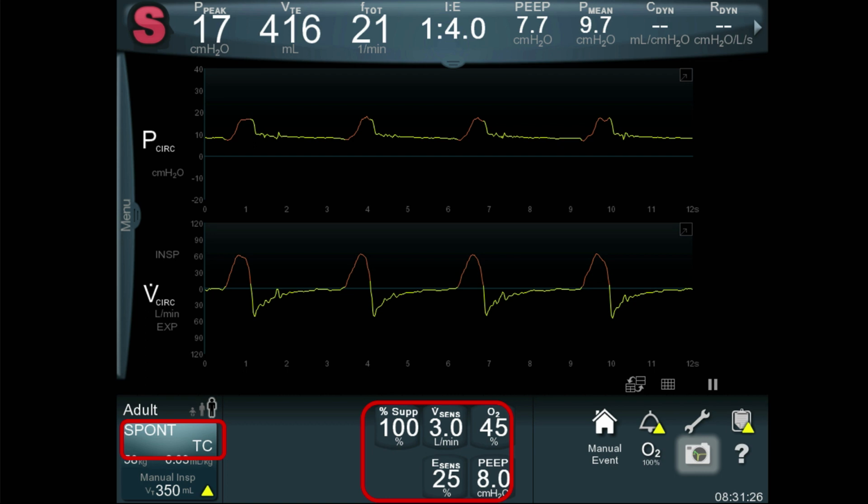The waveform is very roundy looking, right? So this pressure waveform is much more like what you see in CPAP versus what you see on pressure support. It kind of gently guides upwards and then falls away again. And the flow waveform itself, even though it is a decelerating flow waveform that shaves off at 25% of peak flow, it's ever so slightly different.